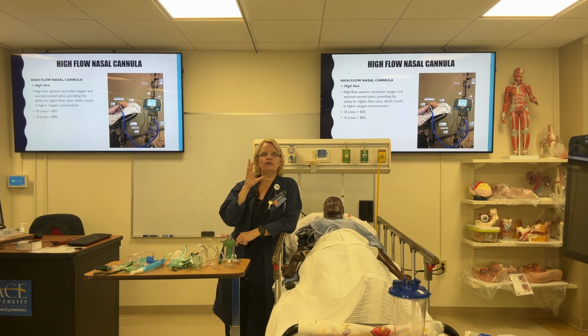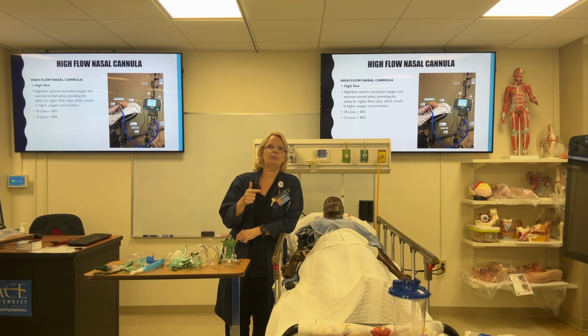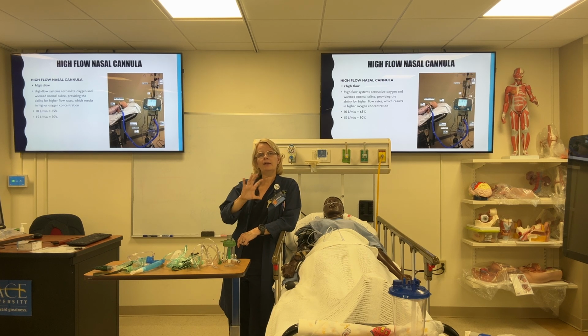If you have too much oxygen flowing and no humidity and no heat, the nasal mucosa is going to get really dry. Sometimes patients get nosebleeds, and some patients, even on high flow nasal cannula with the heat and the humidity, cannot tolerate that high flow rate, and sometimes you have to switch to a different device. But if they can tolerate it, it can be a nice bridge to get them over the hump and keep them from having to be intubated and put on a ventilator.